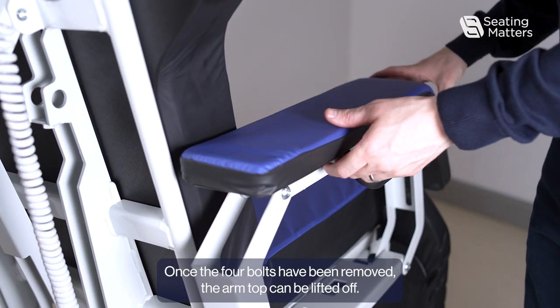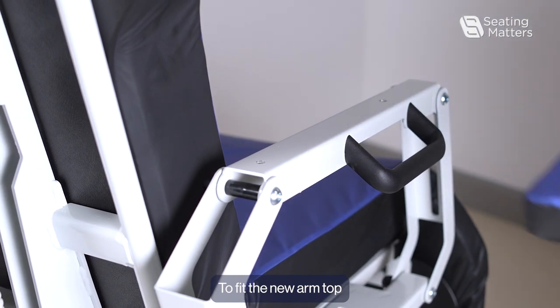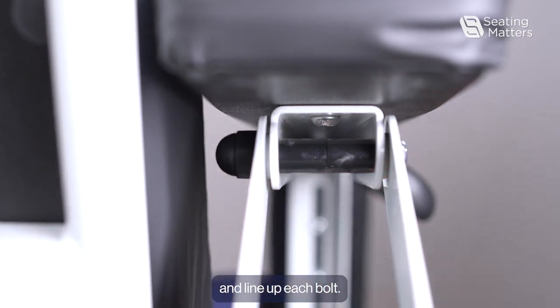Once the four bolts have been removed, the arm top can be lifted off. To fit the new arm top, we just put it back into place and line up each bolt.